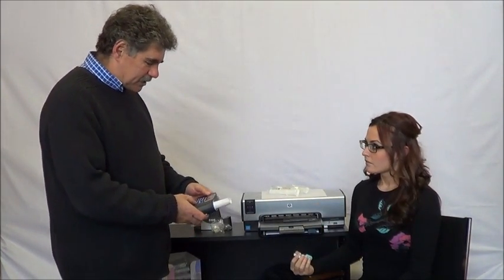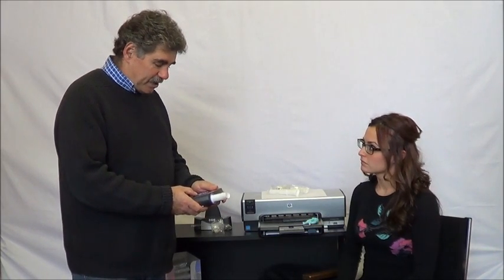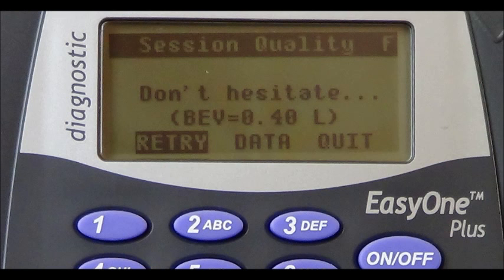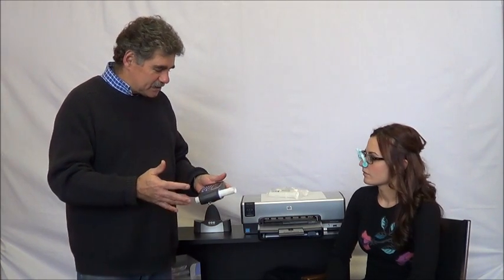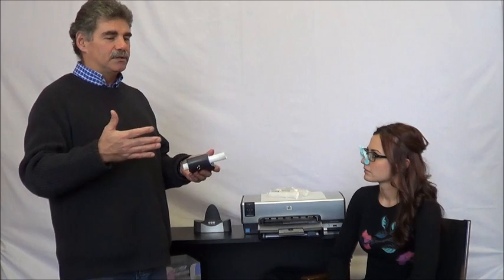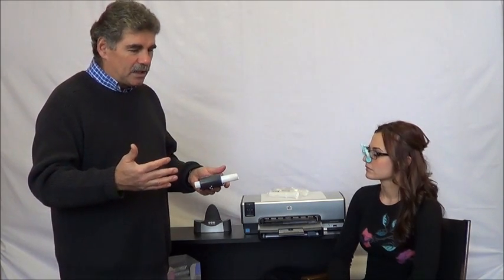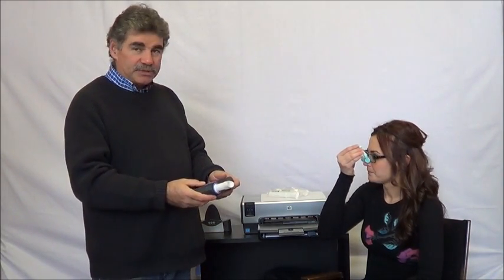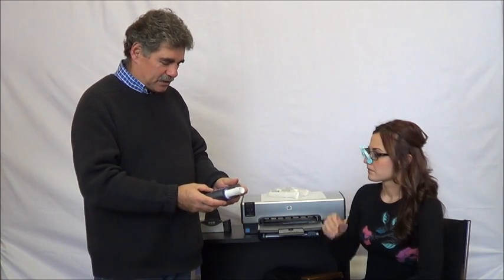The spirometer is telling me 'don't hesitate,' which means that at the very beginning of the test you failed to really blast. So on the next blow, I'm going to have you try to improve upon that. We're ready for the next try. Bianca, this time it's important that after you fill your lungs, you don't start the test until you're ready — and once you're ready, it's a very quick, fast blast, no hesitation at all. I'm going to press retry on the device to start the next blow.